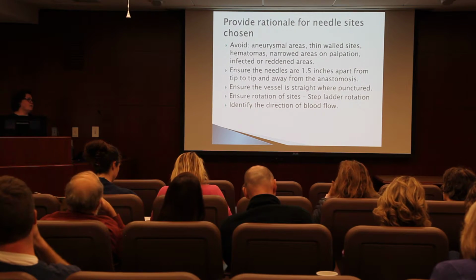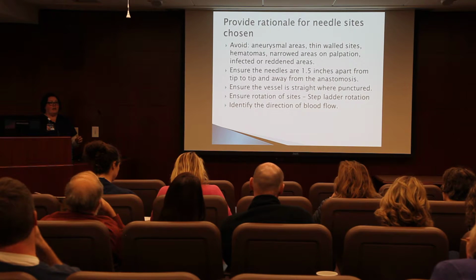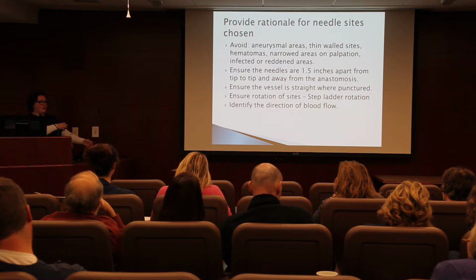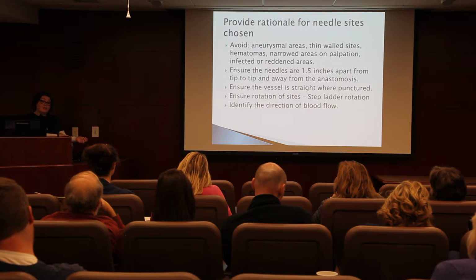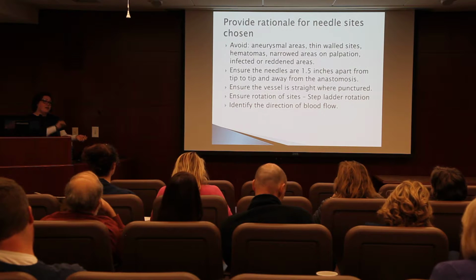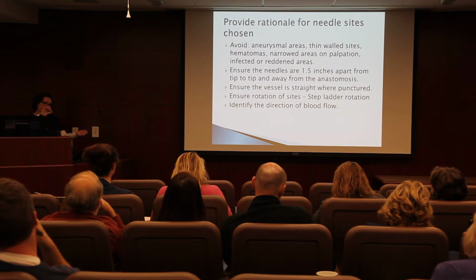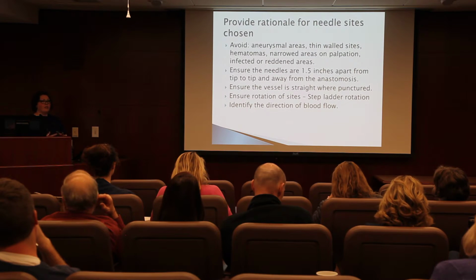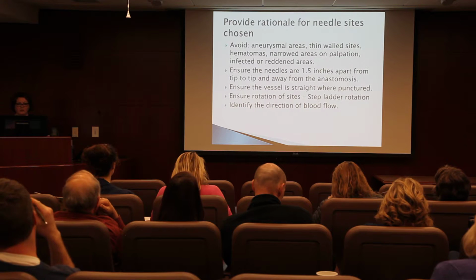Also, going back up to the hematoma, if they've had a previous infiltrate, you probably don't want to stick where you've noticed there's some bruising going on. You may feel the access really, really nicely in that area, but the minute you go in, you're probably going to scoop up a little bit of a blood clot, and then you're not going to be able to pull any blood out of there. So avoid the hematomas as well.